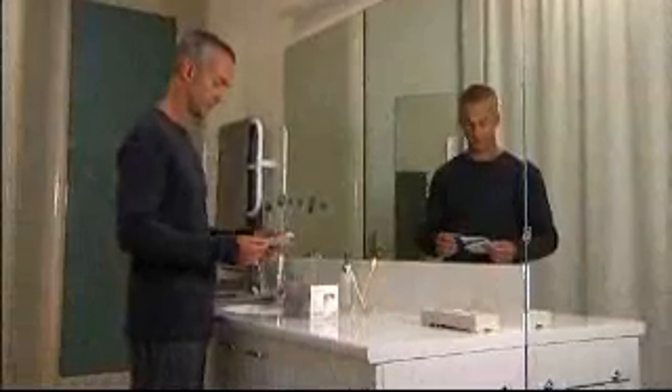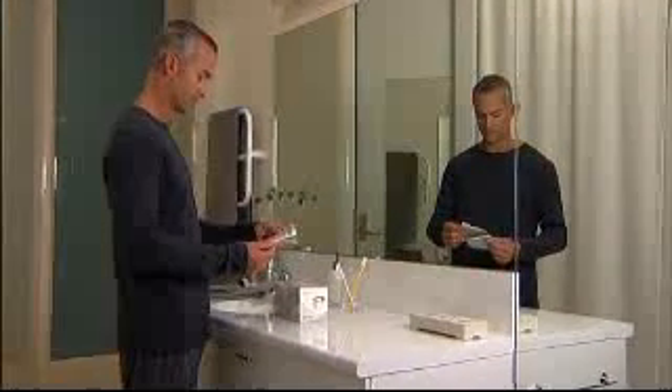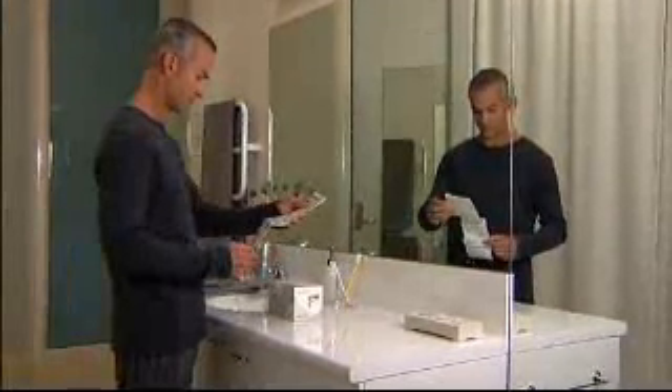You have just received the Fisher & Paykel Healthcare Mask for use with your CPAP. In addition to this video, you should also consult your instruction manual for additional information regarding specific warnings and safety precautions.